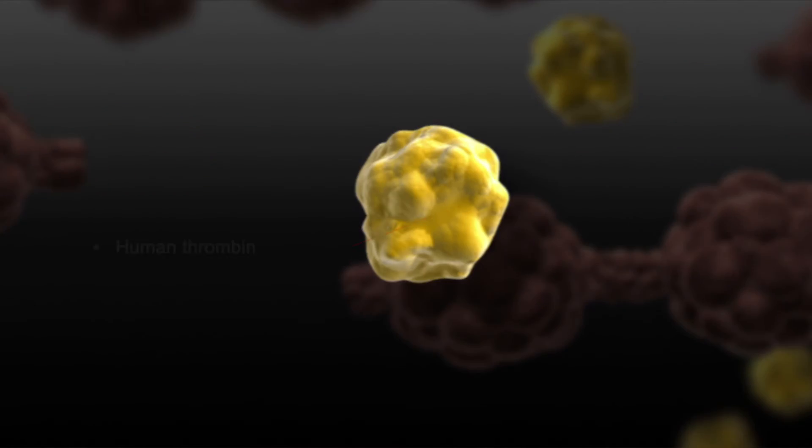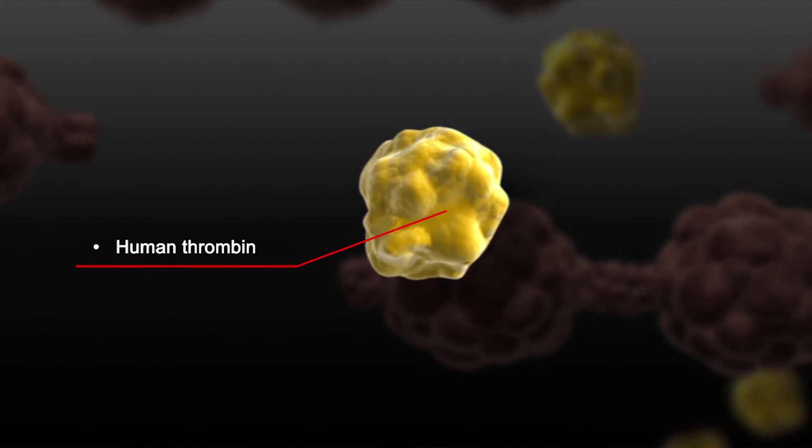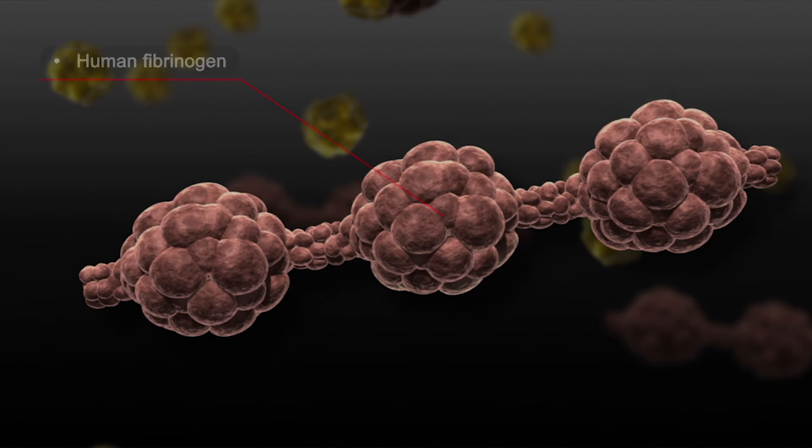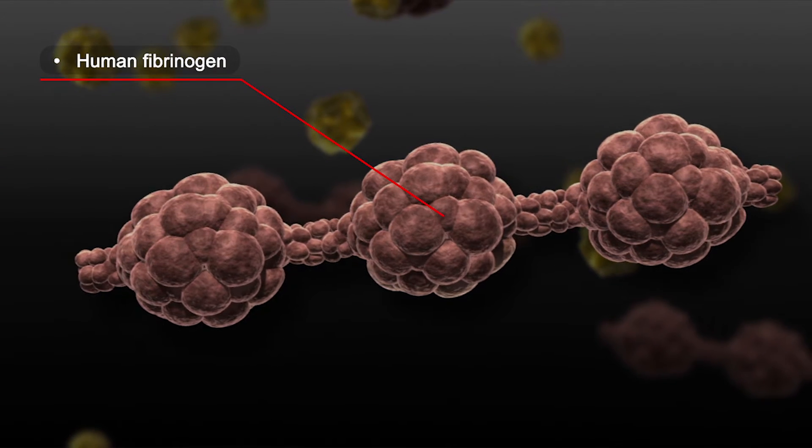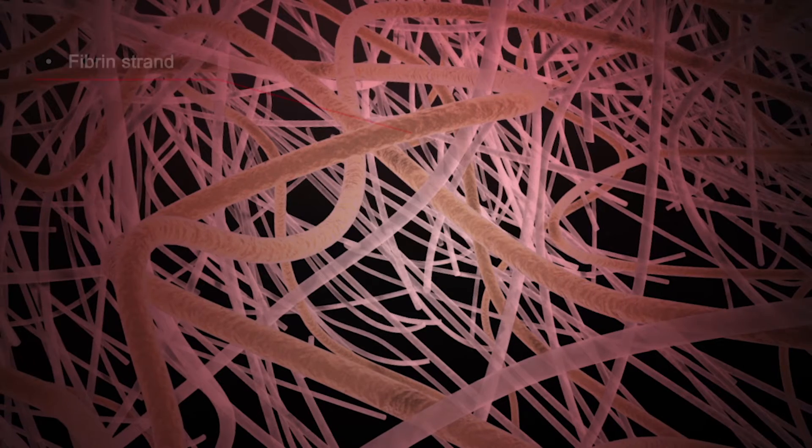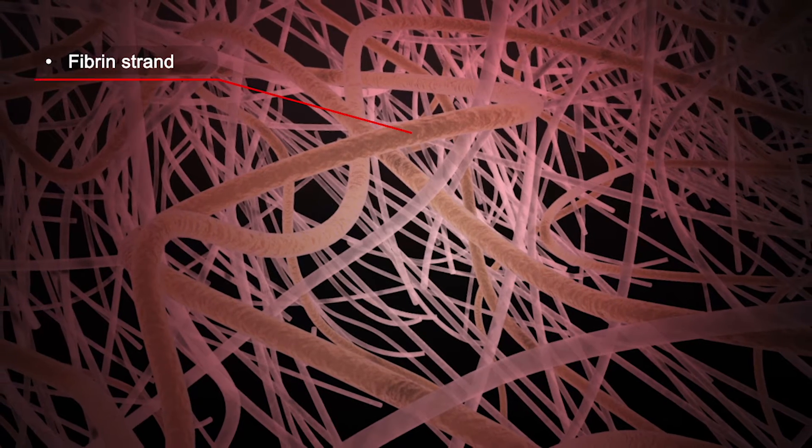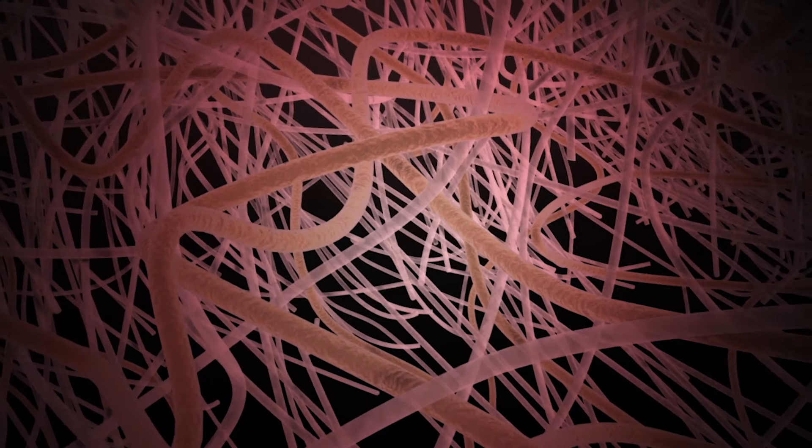The biologics are thrombin, an enzyme in blood that facilitates clotting, and fibrinogen, a protein that interacts with thrombin to form fibrin, the major component of a blood clot. These biologics are uniformly embedded in the patch.